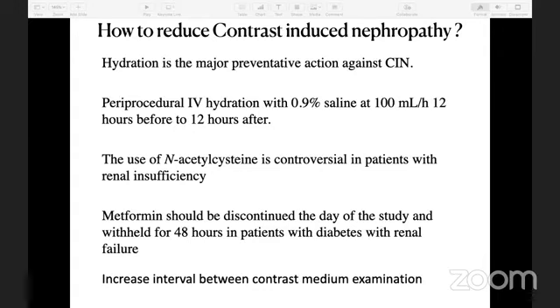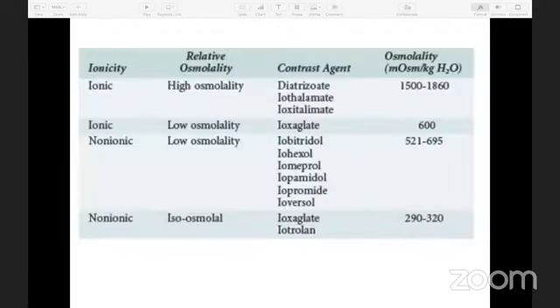for 48 hours. Apart from this, the investigations requiring contrast media should be very well spaced and with the use of iso-osmolar contrast media. With the availability of non-ionic contrast media, the adverse reactions and mortality have significantly reduced, and iso-osmolar contrasts are safer in high-risk cases.